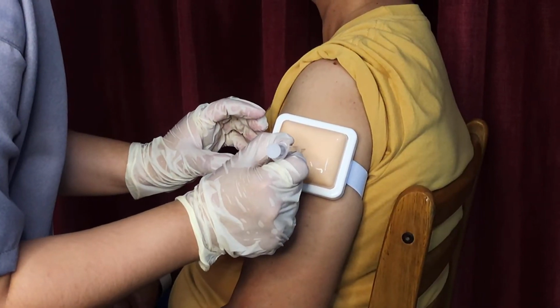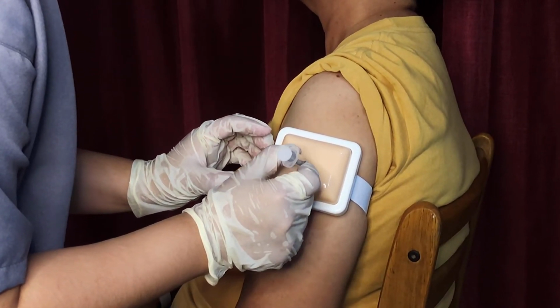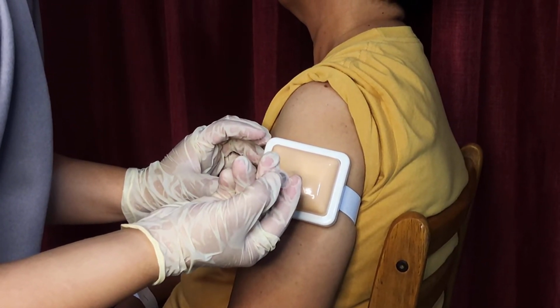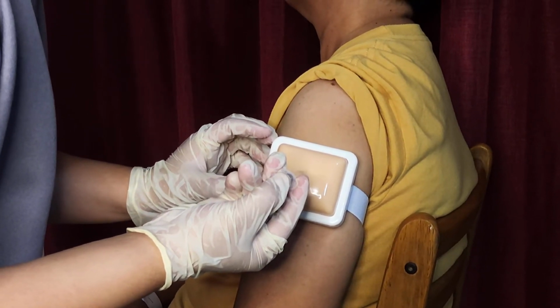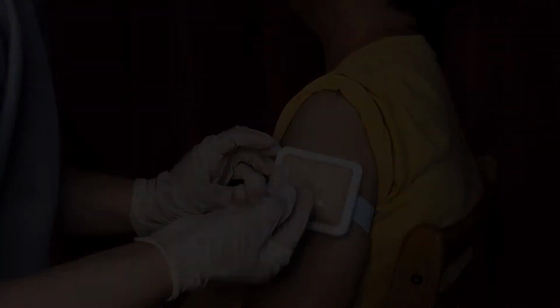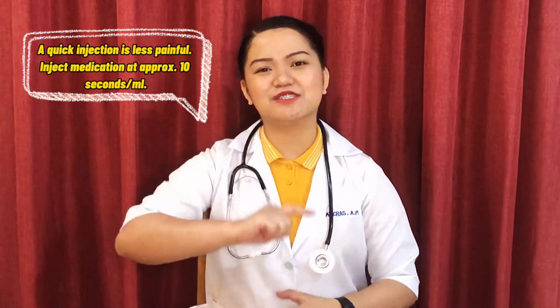And then, quickly insert the needle as if holding a dart at a 90-degree angle. And then, move your dominant hand to the end of the plunger. A quick injection is less painful. Inject medication at approximately 10 seconds per ml because the injection sites recommended for immunizations do not contain large blood vessels. Aspiration is not necessary when giving vaccines.